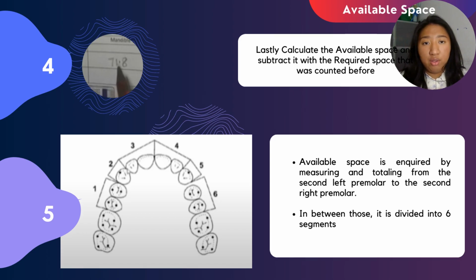So to find the available space, you need to measure the first segment, second segment, third segment, all of them one by one separately. And then, after you have found each segment's measurement, you need to total them up. After you have found the result of the available space based on the measurements of each segment, you need to subtract the number that you found in the required space earlier.